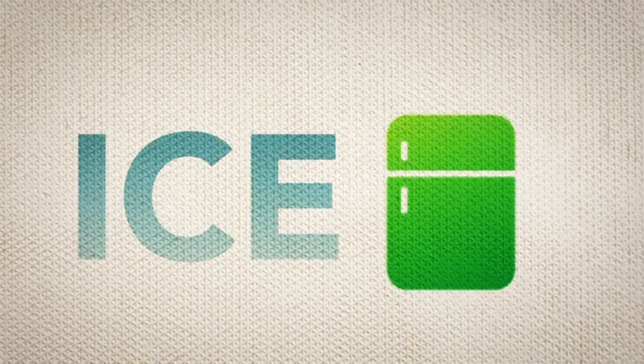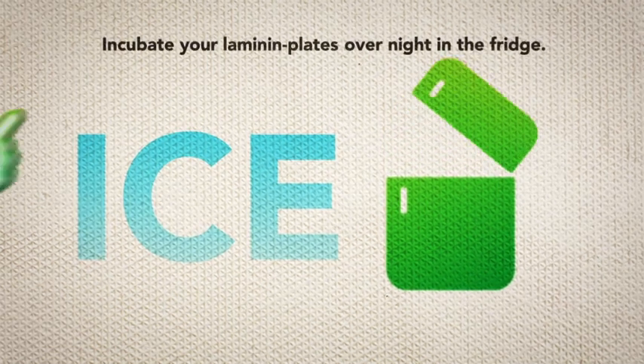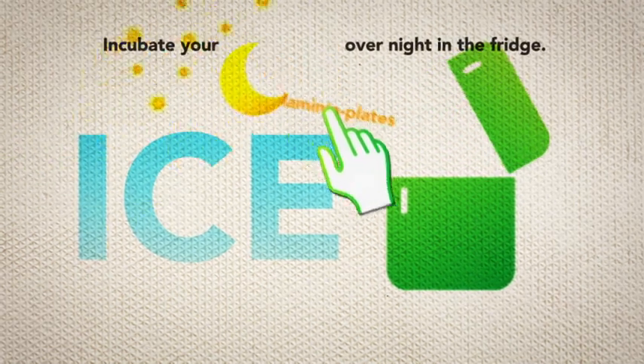Please thaw your human laminin 521 slowly on ice and add an appropriate volume to your plate of choice. Incubate your laminin plates overnight in the fridge.